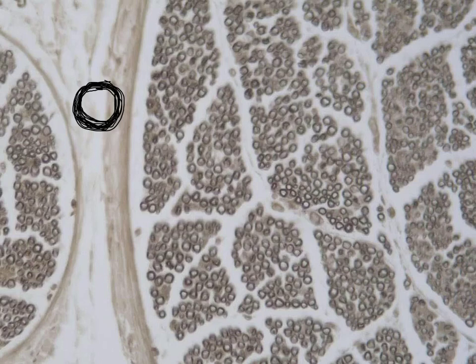And the area inside here represents the place of the axon, which is not stained now, and of course we only have here the myelin sheath, and we don't have the Schwann cell nuclei or the neurolemmal sheath. We only see the area occupied by the myelin sheath as it is fat and dissolves in the osmic acid, taking this black coloration. Also we have here the site of the endoneurium, and we all know that endoneurium is formed of very fine reticular fibers formed by Schwann cells and not so clearly seen.